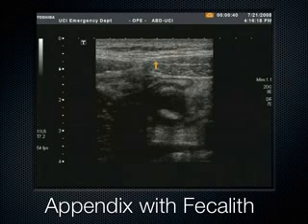There are risks that you can do to patients with ultrasound, such as dislodging a DVT. That does frighten me, but compressing an appendix, I don't think there's enough extrinsic pressure that you could perforate it. I think really the true perforation comes from the inside getting ready to make it pop. Because, yeah, we're pushing a lot of pressure, and maybe I oversold that too much. We're not pushing so hard that we're causing a very local part of it to perforate. I mean, we're pushing enough just to get the muscle bellies to come together.